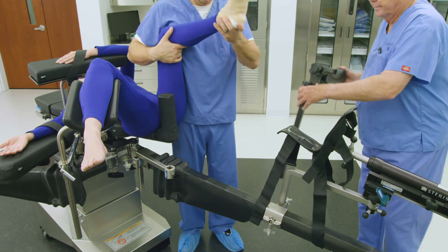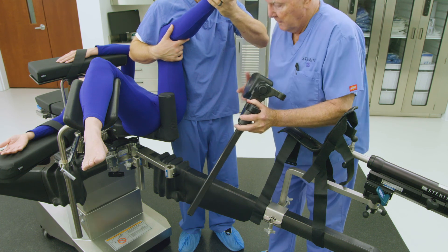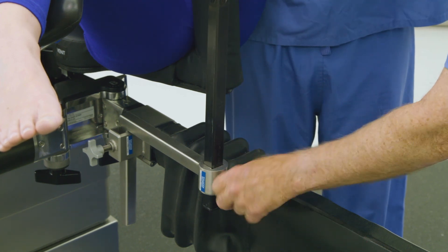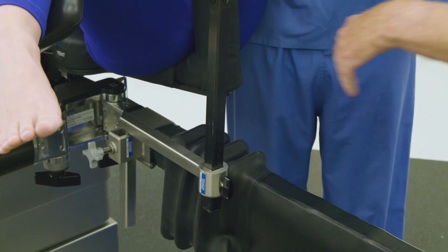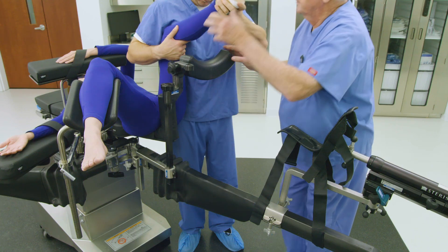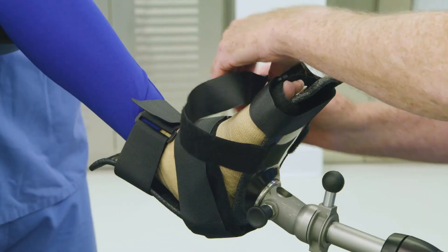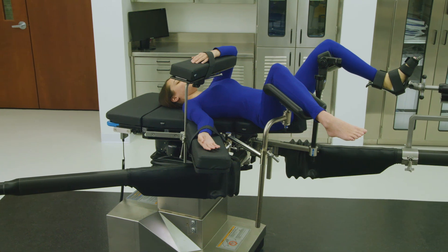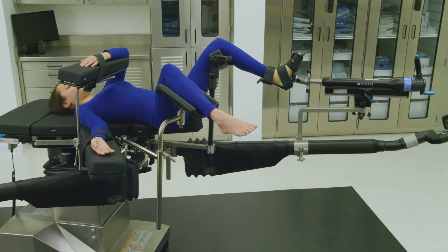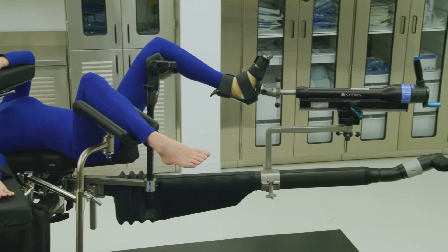To continue positioning the tibia or fibula for relevant orthopedic procedures, the tibia lateral countertraction device must be installed. Insert the long shaft of the tibia lateral countertraction support into the L-shaped extension's distal hole, adjust the height, and tighten the knob to secure. Adjust the countertraction support to the desired angle to accommodate the patient anatomy as shown. Attach the patient's foot to the appropriate boot for lower leg orthopedic procedures. When setup is complete, the Steris OT Table should look like this for the intended procedure. Refer to the OT Table Setup Guide, pages 8 through 21, for written instructions on setting up the table for this orthopedic case.